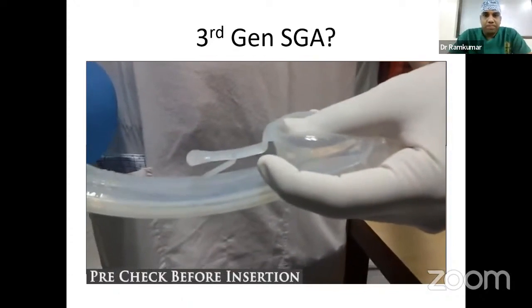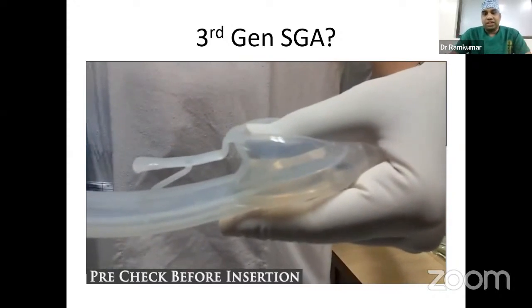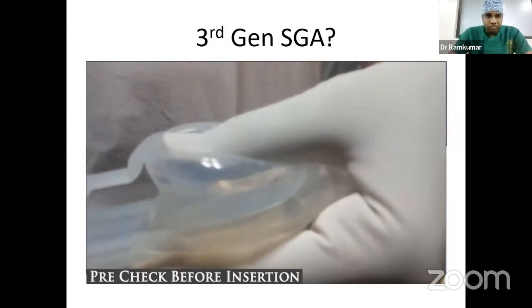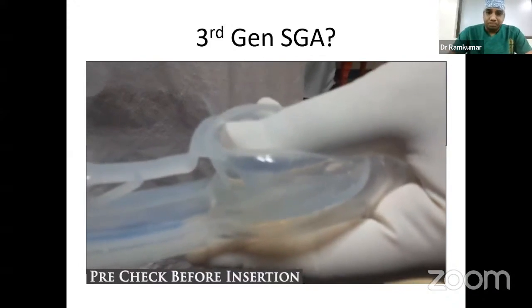That means that as the airway pressure increases, the seal increases. The seal with a glottis or periglottic structure increases. Whereas with other devices, when the airway pressure increases beyond their limit, like 30 centimeters of water or whatever is appropriate for that particular device, there's a chance of leak. So here, with the Baska mask, as the airway pressure increases, the seal increases.